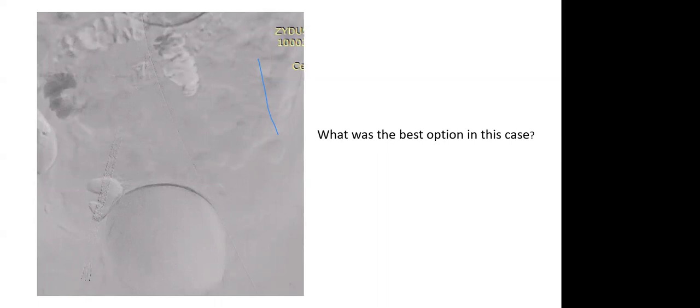What I was asking is, previously in the aortoiliac cases I have done, I used to put a 6 centimeter or 4 centimeter long 14 mm stent in the infrarenal aorta, and then do two kissing stents of 7 mm in both common iliacs. In this case, I have not done that. Generally, in cases done recently here, we are putting just 2 stents parallelly in the aorta. The other approach is technically a bit more time consuming, and the aortic diameter and stent availability also need to be assessed. So a double barrel parallelly from the aorta into each of the iliacs, but again, it is a personal choice. I thought it was more physiological, sir, that's why we used a larger one at the infrarenal aorta and two smaller ones in the iliacs.